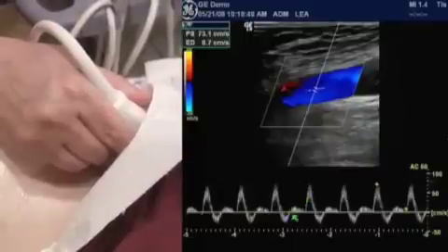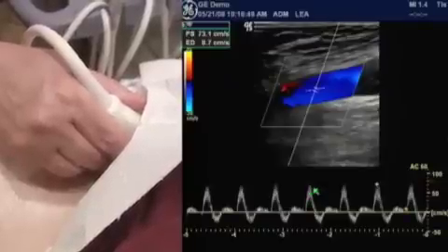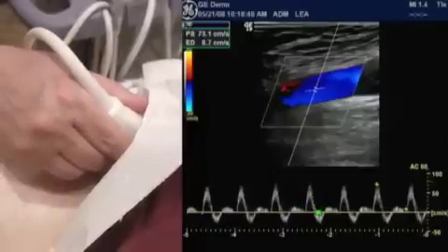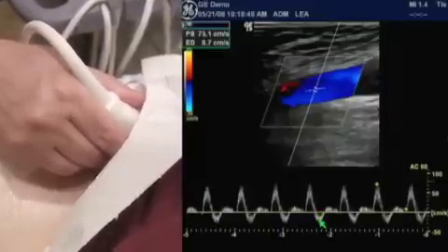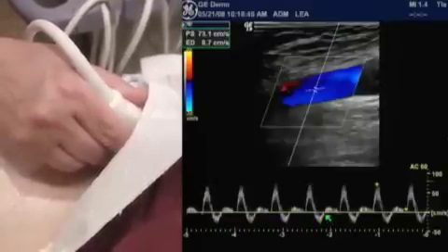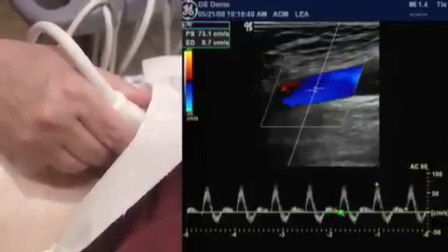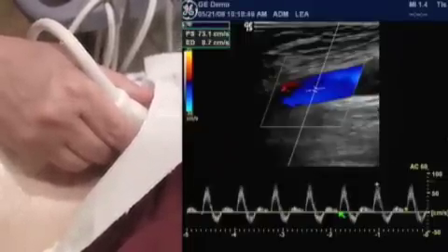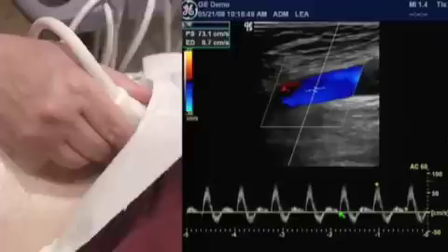But we can see here clearly on the screen, this is a nice sharp upstroke, a narrow peak, a rapid deceleration. So this is a very good upstroke here in systole, and it's telling us that that blood flow has not passed through any kind of a stenosis in any way. We see the reflected wave here telling us we're dealing with a high resistance bed, again, textbook normal. And this third component in end diastole, this antegrade flow at the end of diastole, is basically due to healthy, compliant elasticity of the vessels further central to where we're imaging.